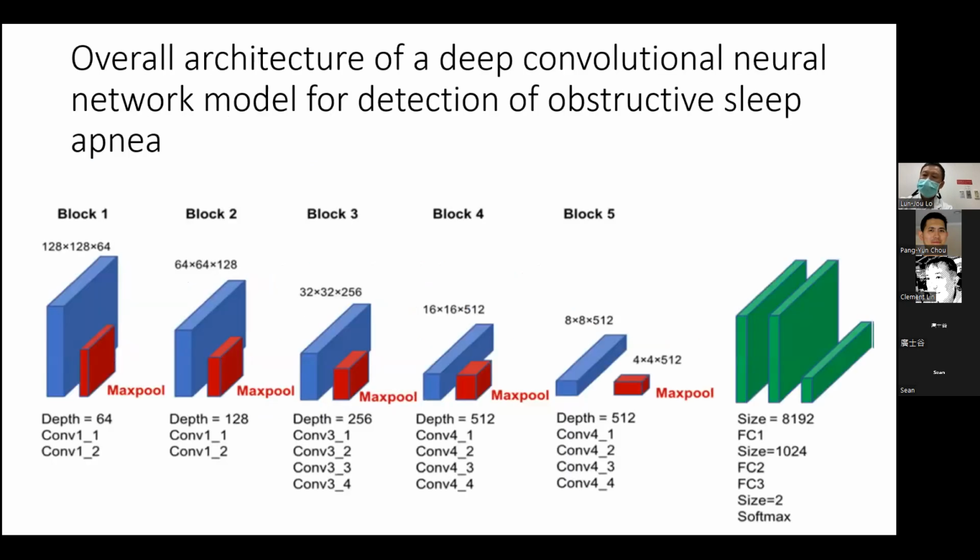And in this paper, he used a 2D lateral cephalogram as the input and combined a deep convolutional neural network. The network included 5 different blocks, and in each block, we resize the whole pixels of the lateral cephalograms. After the 5 blocks, we extract different features in the image. In the end, we flatten the network and connect it with a fully feed-forward neural network, resulting in a binary outcome to tell us if these patients have high risk of OSA or low risk of OSA.